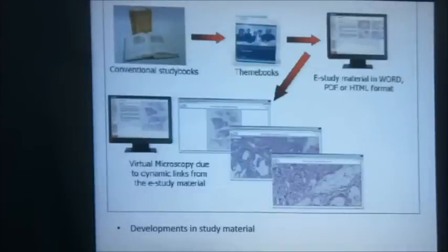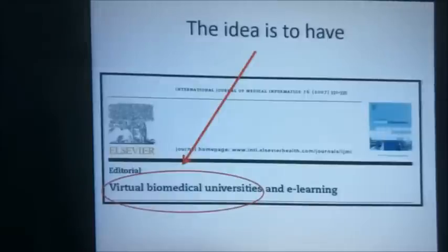The first idea was, how can you study? The conventional study is to use books like an atlas or whatever, theme books, e-study material, either in Word or HTML format. But now we are using the actual live, what's called virtual microscopy, in which you can actually see the slide, you can magnify or see details of any part of the slide remotely from any place. This is now the era, which is virtual microscopy or e-study using the slide.